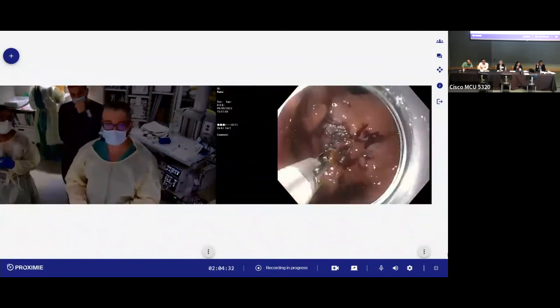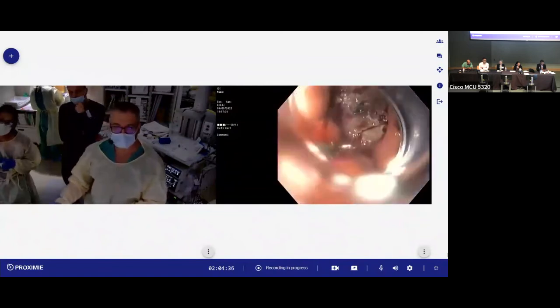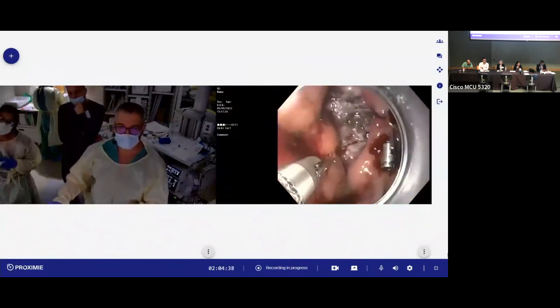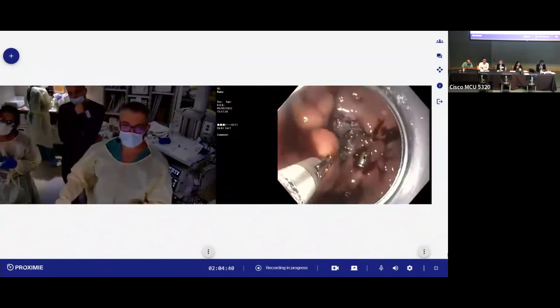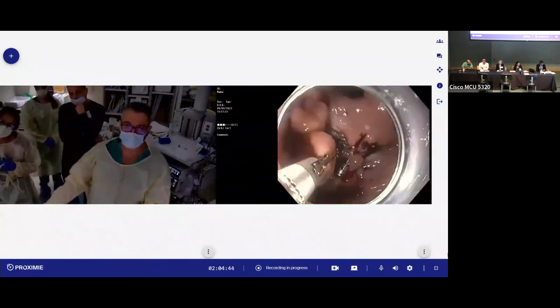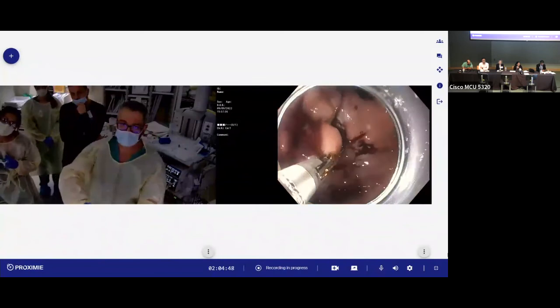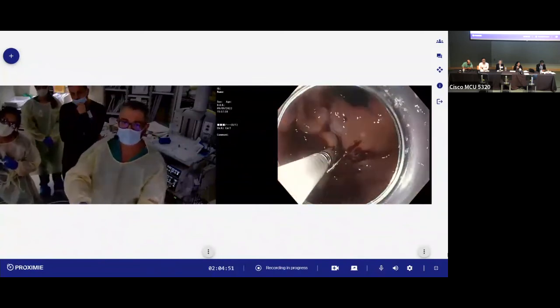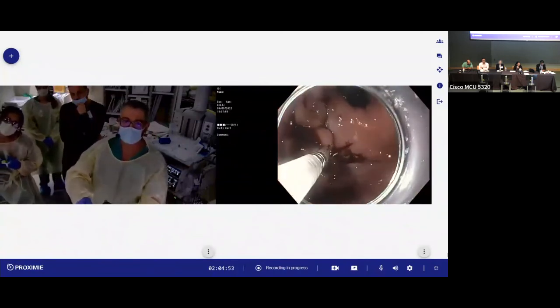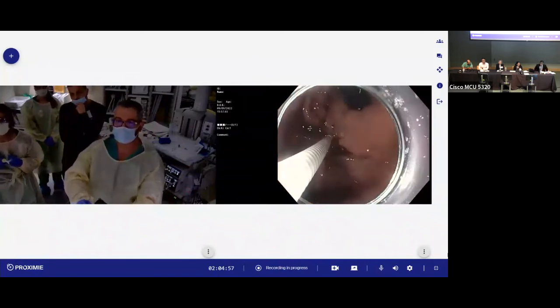So open the silver one now. We'll go to this area, close. My challenge here is that the position of the endoscope is not going all the way where I want it to go, but we'll try to do it. Let's open the gold part. Close. Deploy.